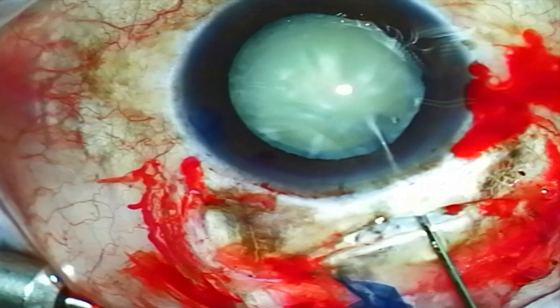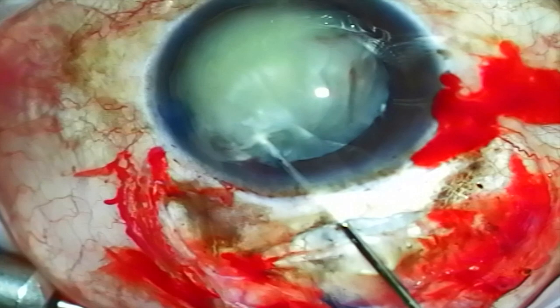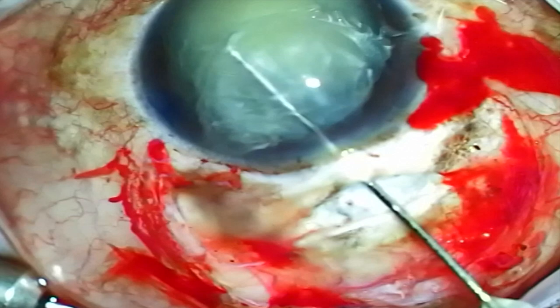This first video is a mature white lens. Using the Chang cannula, I'm performing hydrodissection and at the same time rotating the lens nucleus. I'm also applying a little bit of downward pressure at the edge of the lens, and this allows the opposite edge to prolapse up into the anterior chamber.